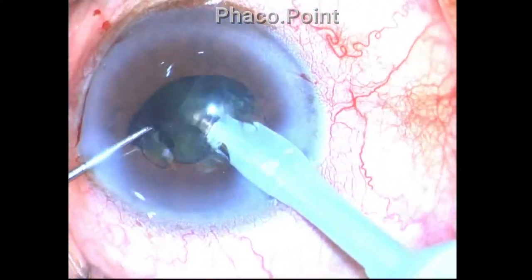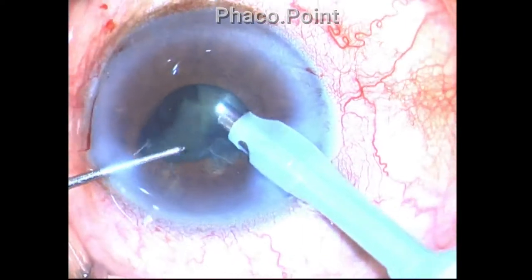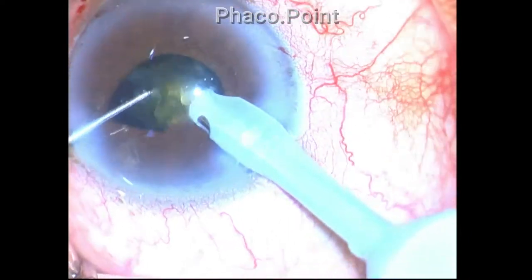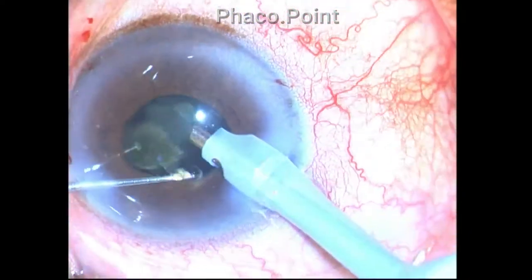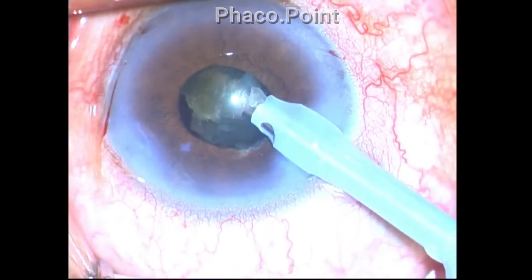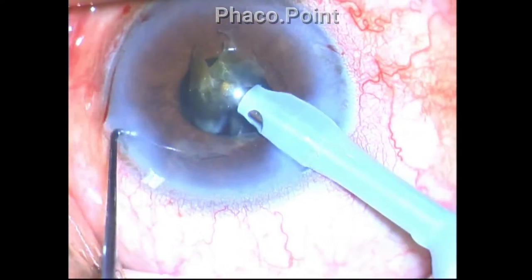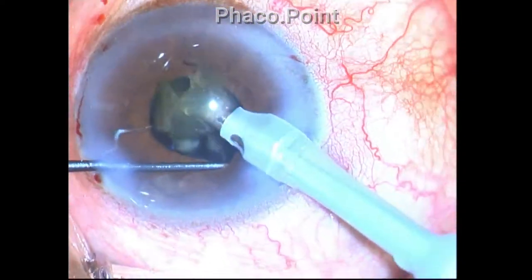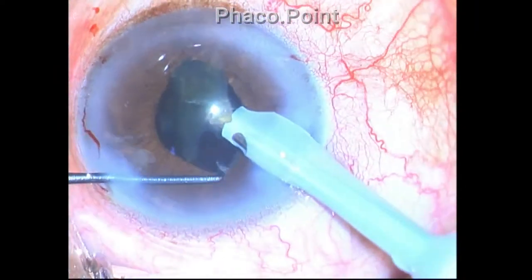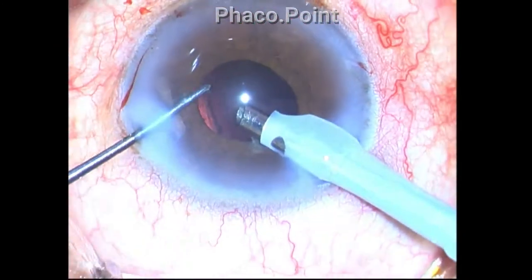To keep the phaco probe well away from the chafed portion of the iris, I perform phaco emulsification — the trick is to activate phaco power only after the bevel has been occluded by the nucleus fragment. Because there is a tendency for the iris to come into the phaco probe, I use a ball dialer — the Tennant's nucleus manipulator — which acts like an iris hook to keep the chafed portion of the iris away from the phaco probe.